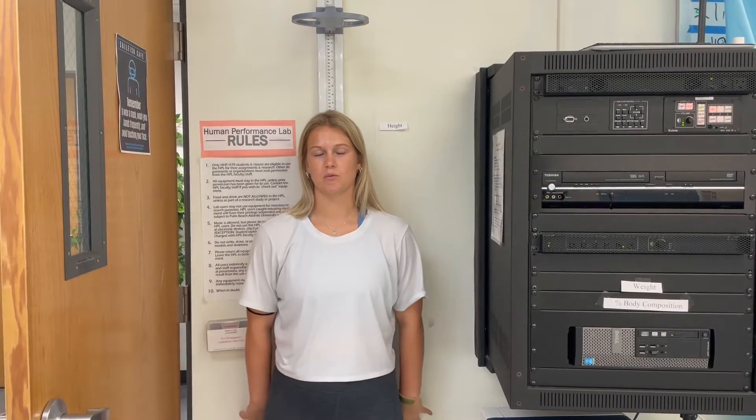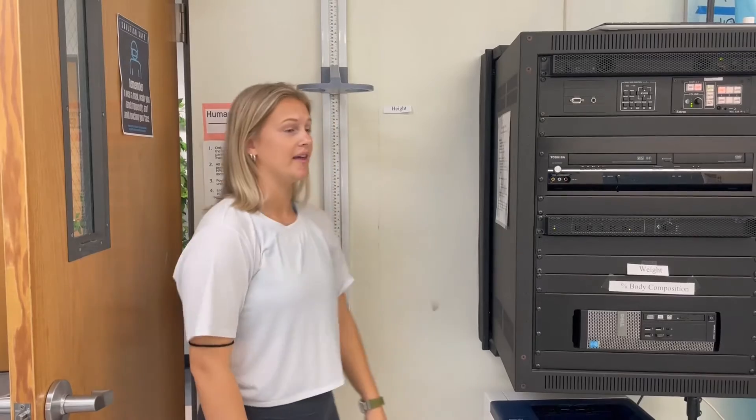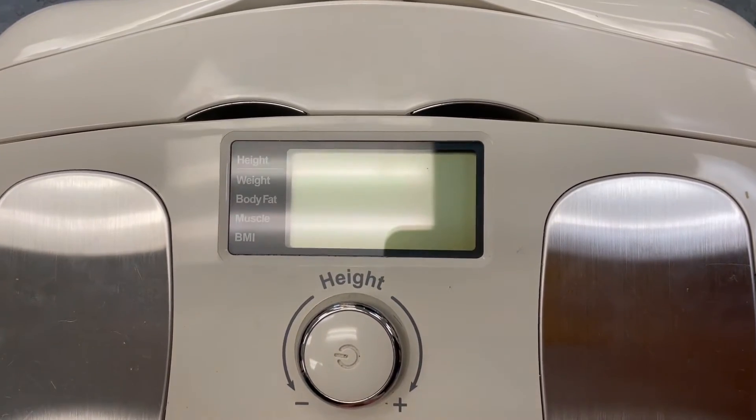Welcome to the body composition lab. For this lab we have three different ways of measuring body composition: the scale, the handheld monitor, and the Bod Pod. For all these tests we need height, so the first thing we're going to do is take your subject's height. Have them walk all the way back to the wall facing outwards, take the bar above them, and pull it down to rest just on top of their head. You can then see their height listed in inches and in centimeters. This subject is five six.